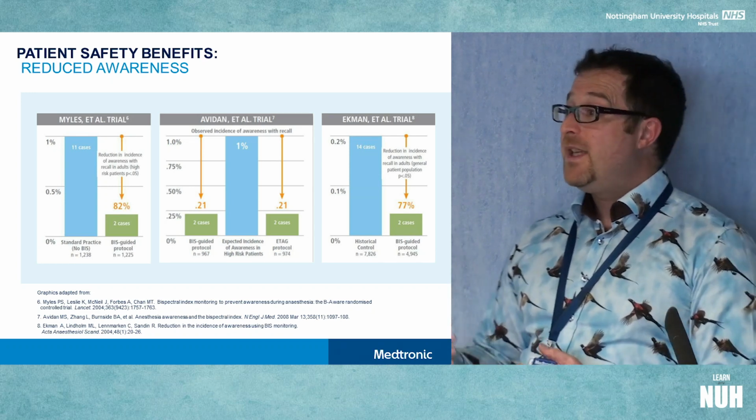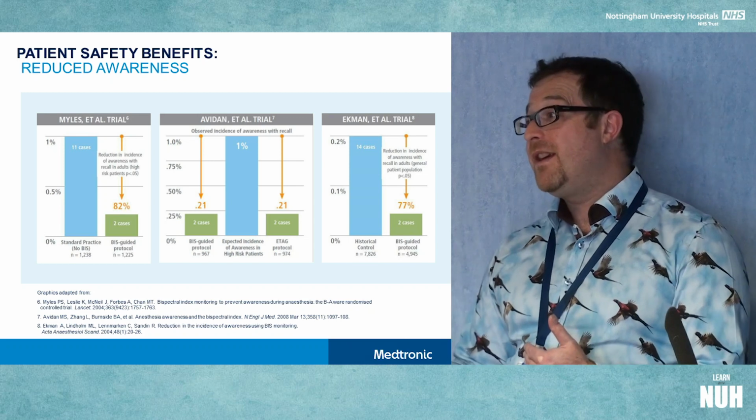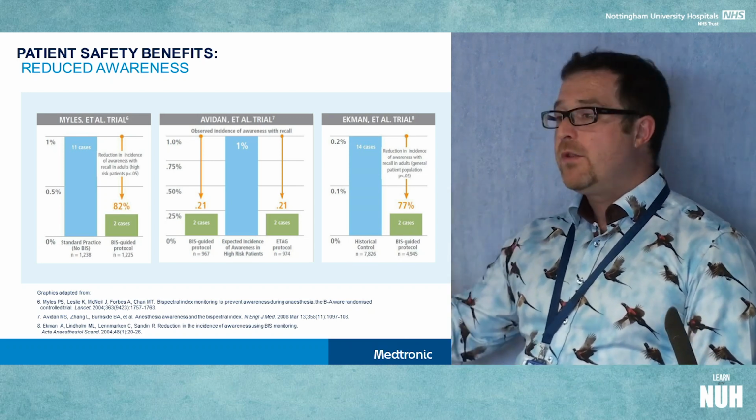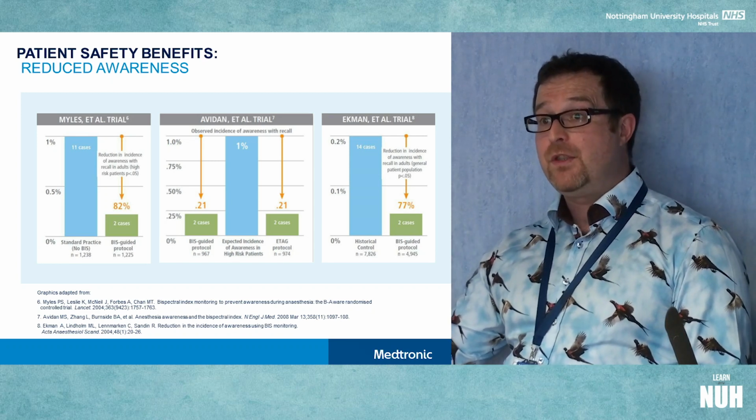So again, it seems to be if you're running a MAC over a certain level, your probability of awareness is quite low. But what we don't know is how many of those patients were too deep.